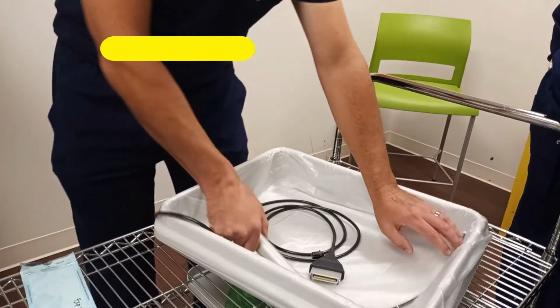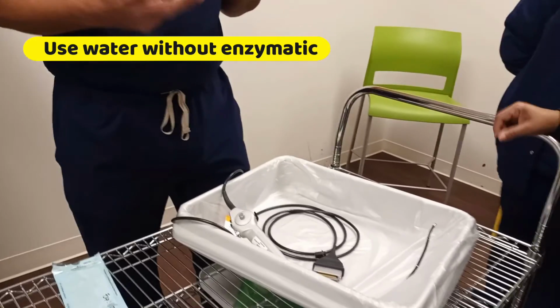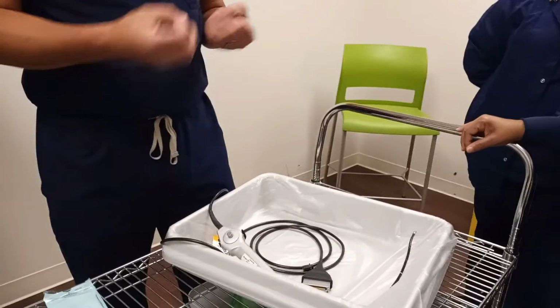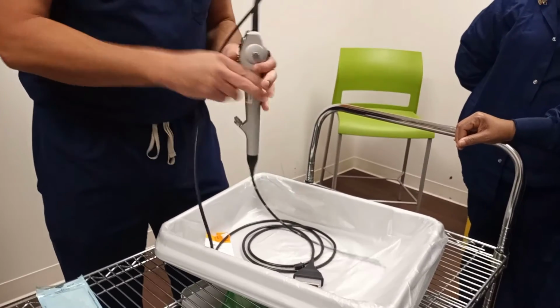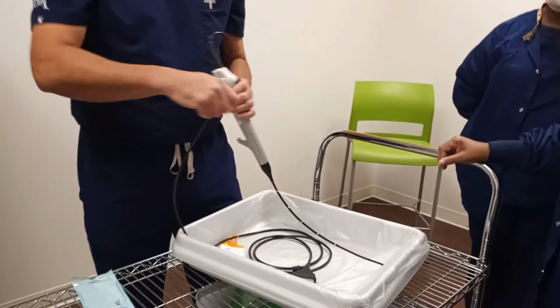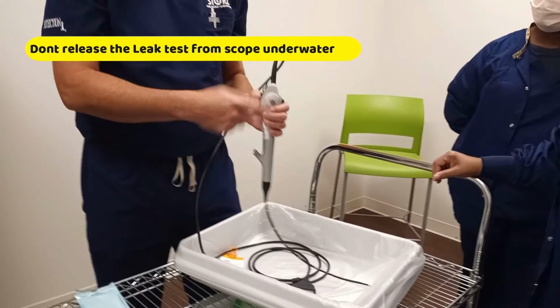You're going to do this in water without the enzymatic mixed in. That way, if the enzymatic is mixed in, you're not getting any false results of bubbles from the soap popping up. So once it passes the wet leak test, you're going to pull the scope out of the water. You don't want to release the leak tester inside of the water. Again, it's going to open up the port.